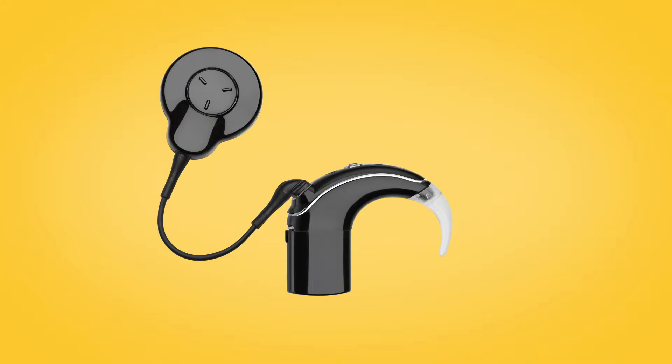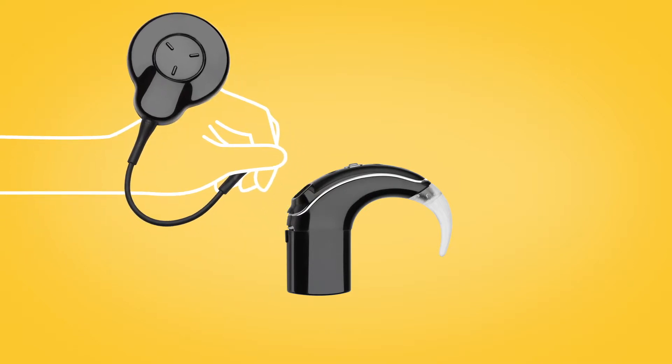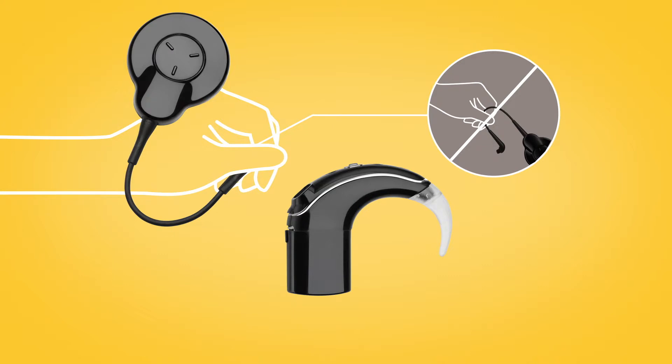To use Aqua Plus, first carefully unplug your usual coil from the sound processor by holding the coil cable grip and firmly pulling it straight out of the sound processor. Be careful not to pull on or twist the coil.